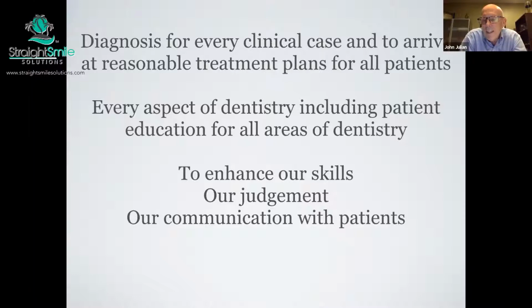As far as pedodontics or orthodontics and age of patients, it's still a matter of being accurate in the diagnosis. And if we're accurate in our diagnosis, we will plan our cases well. I'm a believer in early orthodontic treatment, and I believe that early orthodontic treatment can begin as soon as you see tooth position and eruption patterns. So I feel like a cone beam is even more applicable in children than panorexes or other types of radiographic imaging.